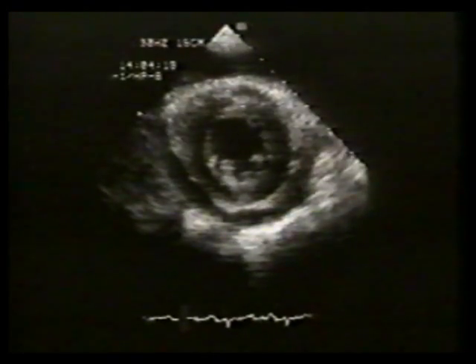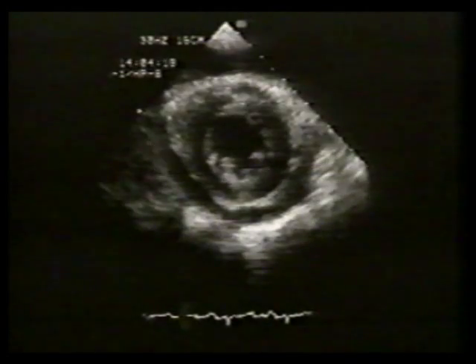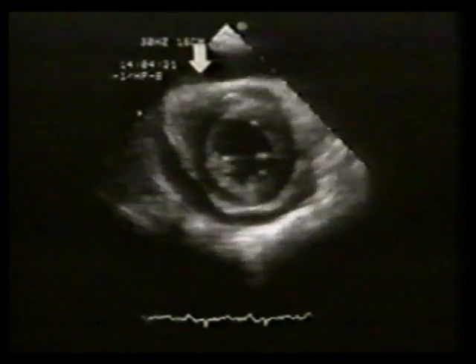This is a parasternal short axis view from the 58-year-old female with systemic lupus and moderate pericardial effusion. This is diastolic RV collapse.